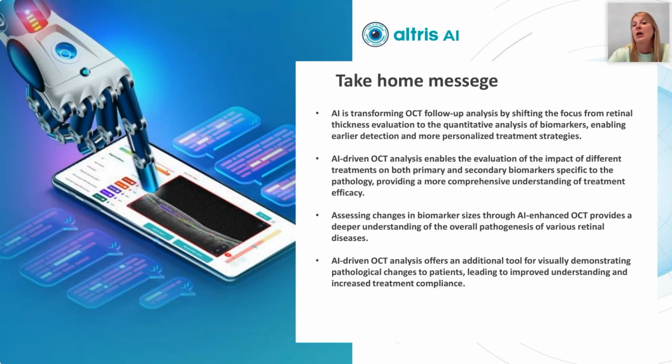For example, do we know how anti-VEGF therapy influences, let's say, epiretinal membranes? Not really. And it might be really interesting for research purposes as well as clinical purposes, because we can track, for example, different types of fluids.